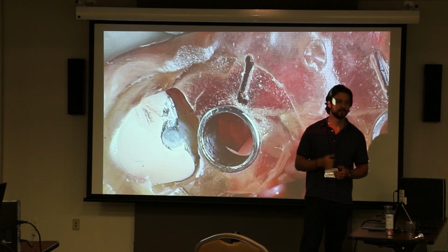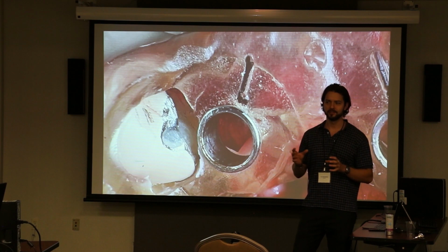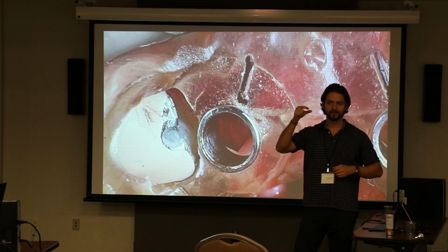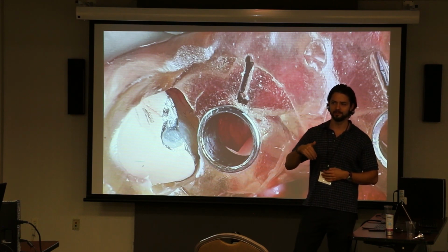And that's actually one other thing that I didn't mention about timing. It's super important for full arch cases. So for full arch cases, we're going to be using multi-unit abutments. And if you're not using straight multi-units, if you're using 17 degree, 30 degree, they all are very, very sensitive to the timing of the implant placements, because your posterior ones are going to be angled. To account for the angle, you have to predetermine where those temporary cylinders have to be exiting and where the angles of the angled multi-units are going to be coming out from.